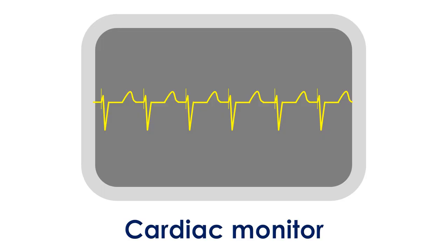Pacing and sensing function of the device has to be checked regularly while in the intensive care unit, as the temporary pacing lead may move and result in loss of function. Temporary pacing wire is removed cautiously once the heart rate has recovered or if a permanent pacemaker has been implanted and become functional.